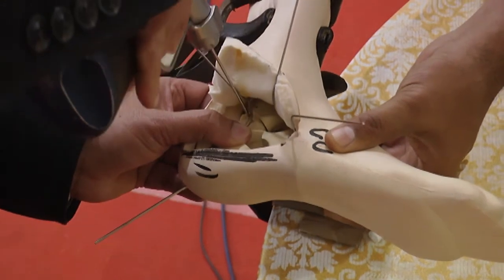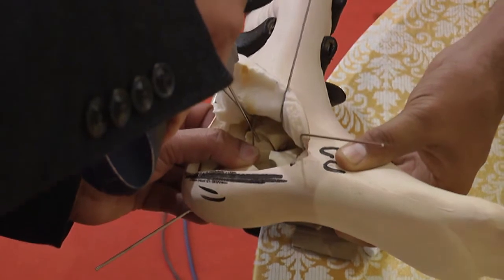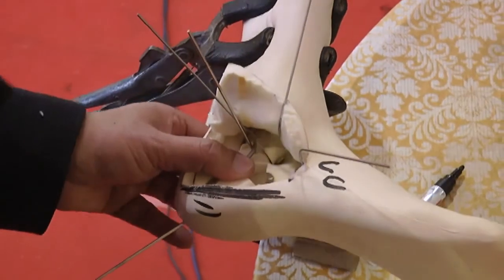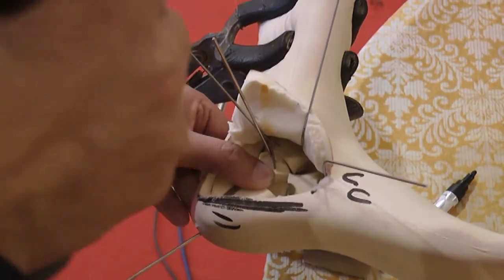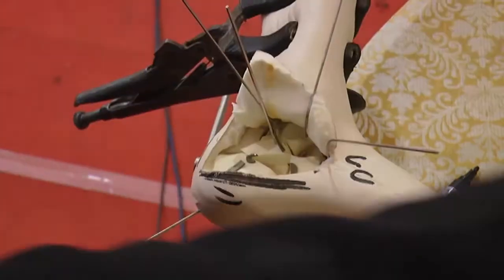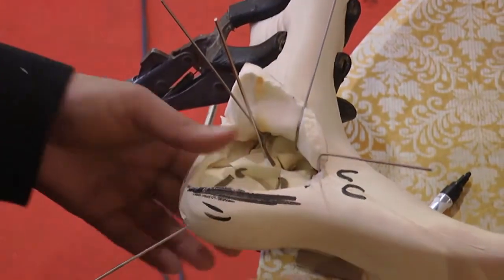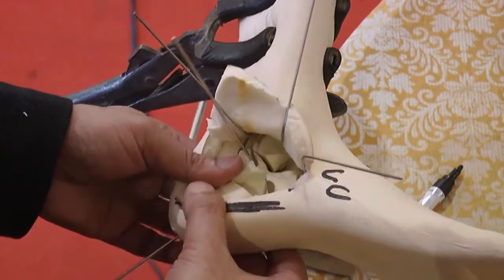Now this step has to be monitored in an axial view, that you are going into the sustentaculum tali and not under it. Under it is the FHL tendon and the neurovascular structure, which if you drill on that area, you will injure those structures. So this fixes the lateral wall, and then you take an axial view, take a Broden view.